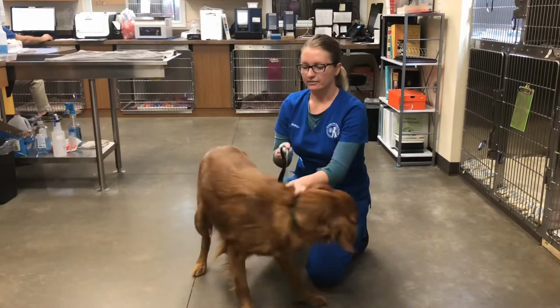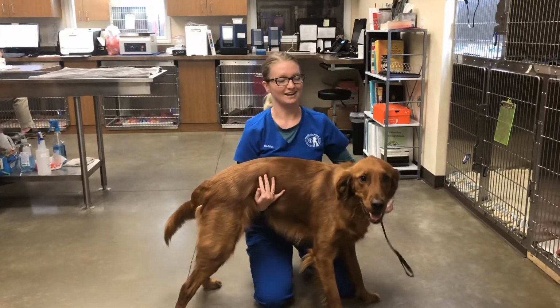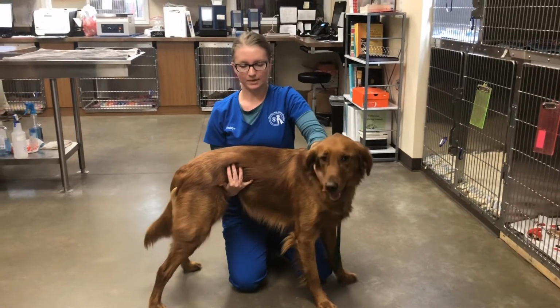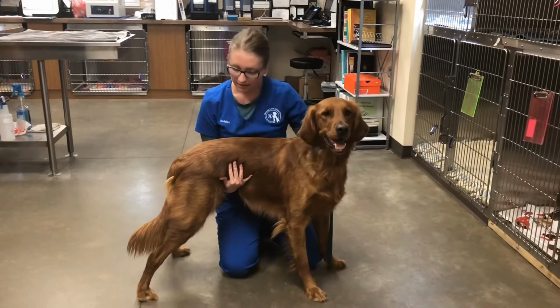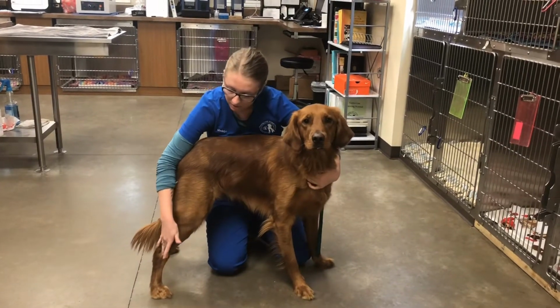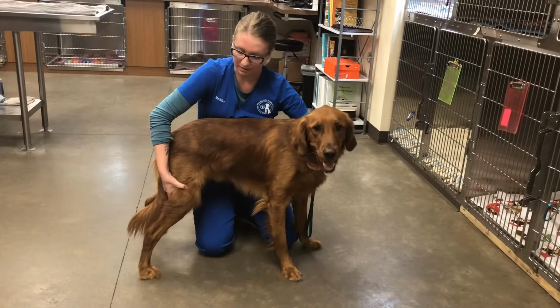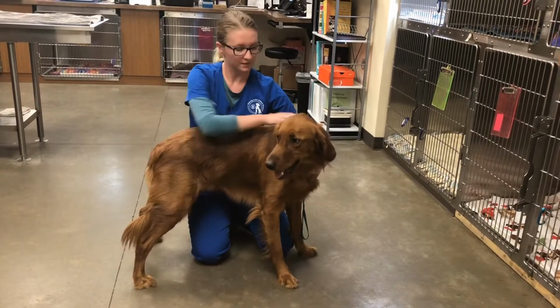Lastly, for the lateral saphenous, they'll be in standing restraint. So I'll keep one hand and position his head away. I'll keep my body pressed up against him so that he doesn't want to move in any direction. And then the saphenous vein on the lateral aspect runs along this side of his leg here. So to occlude the vein, I'll apply pressure up here so that the vein pops down there, and then just keep control of him the whole time. And that's it.